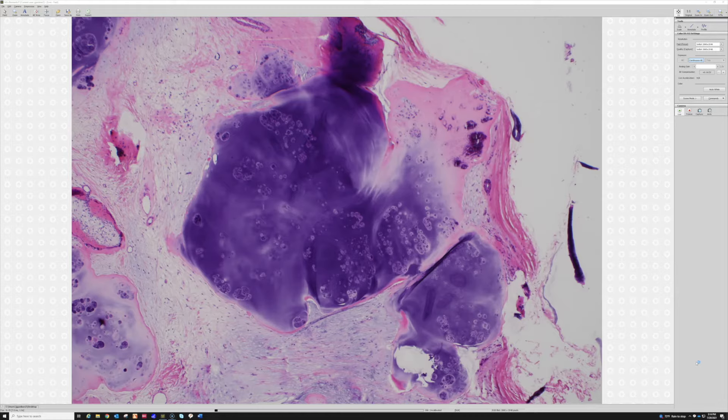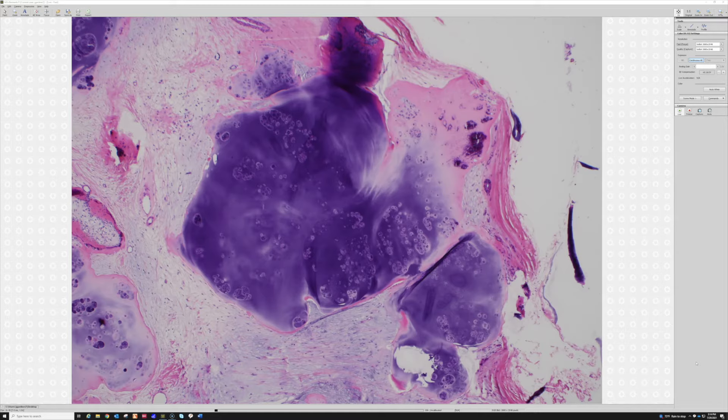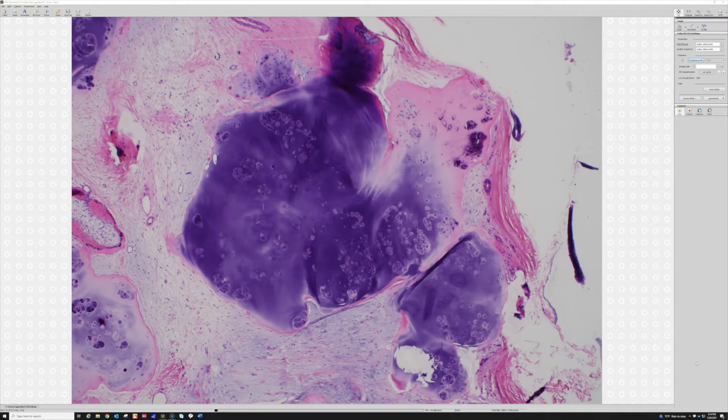Someone will go in thinking it's a little soft tissue mass, they scrape out some pieces, I see some bone and cartilage, but it's not clear to me if this is arising totally in the soft tissue, if it's growing off the outer cortical surface of the phalanx bone, or if they're actually down in the bone. Unless you have the operative note or imaging studies, you can't always tell.